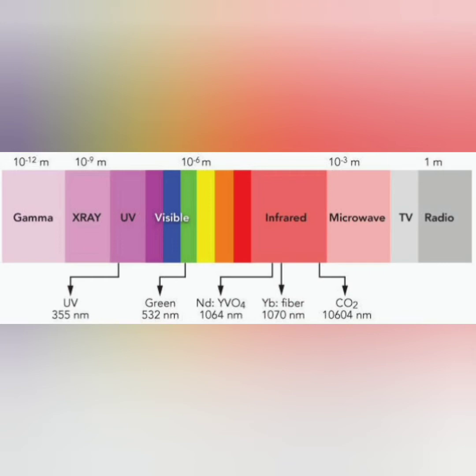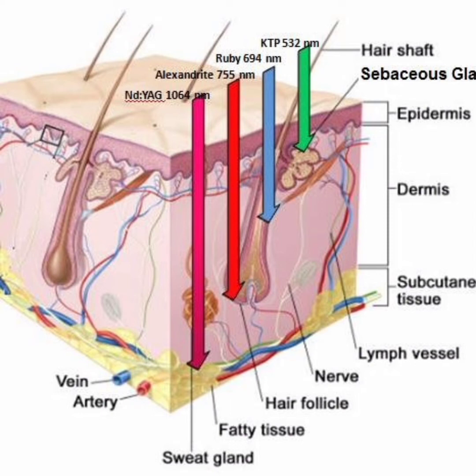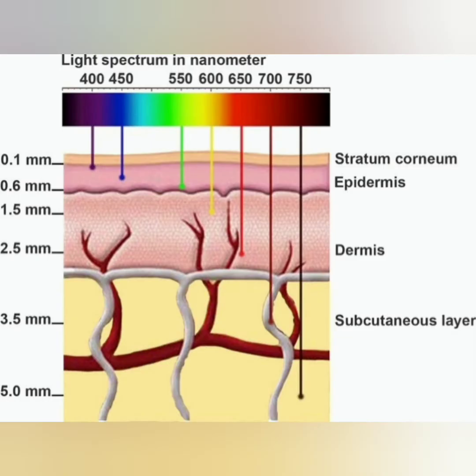So pulse light can be customized for each individual patient. An experienced physician of a pulse light device can customize settings to select the wavelengths, number of pulses and the duration of pulses, also the delay between the pulses and the power delivered to best match the relative depth, size and absorption characteristics of the intended target and avoid the settings that would cause damage to the areas that need to be preserved. So when I show you the IPL machine, I'll show you how each setting is done.